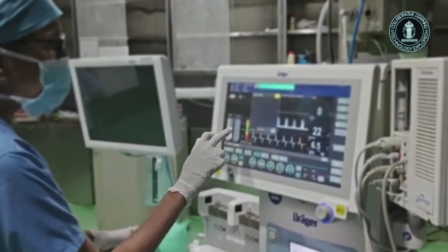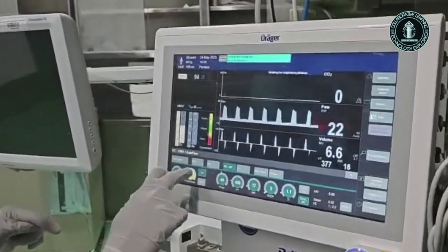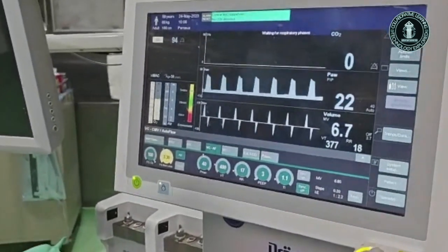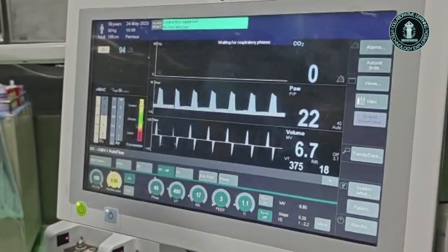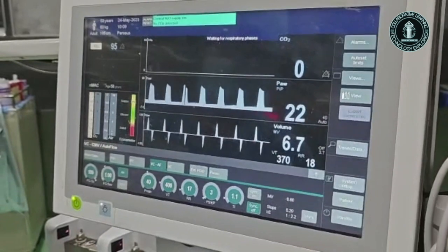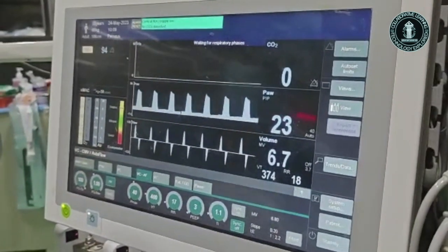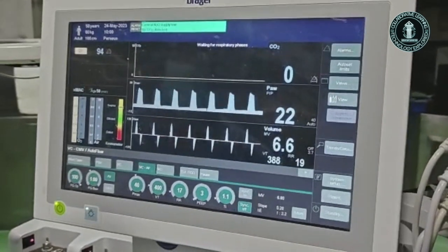The useful thing, particularly in training institutions, is to know if you are setting a low flow that is adequate to the patient demands. Most of us will use flows of 1 liter or less during our surgery, and most of the time this appears to be adequate, except in extreme laparoscopy when you may have to increase the rate and minute ventilation commensurate with the CO2 load.